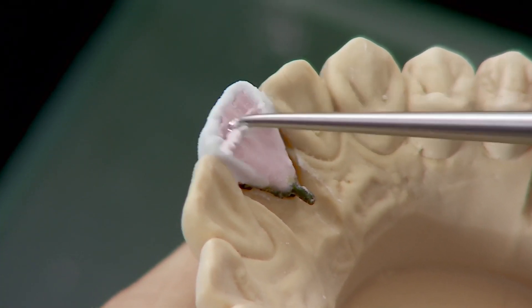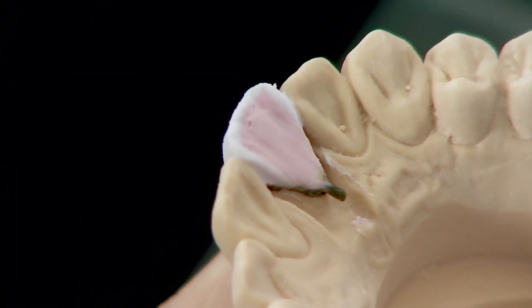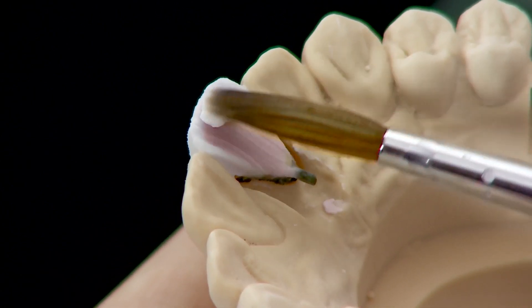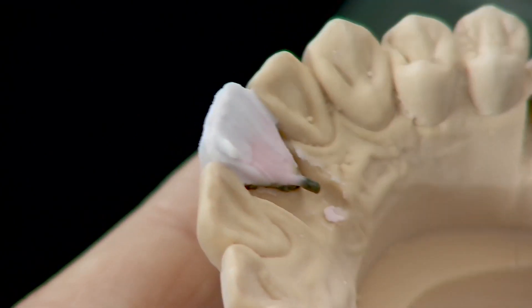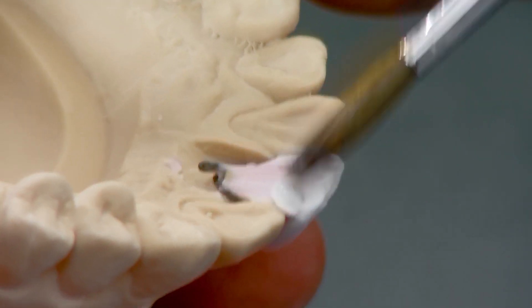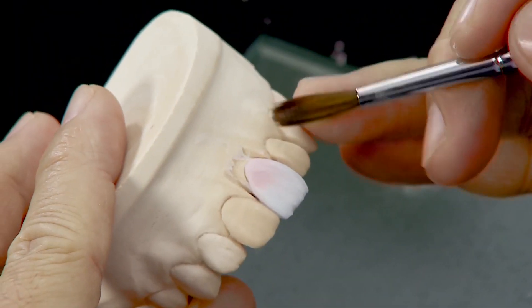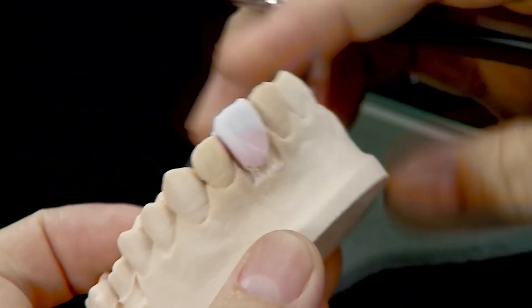Reduce the porcelain at the incisal edge both labially and lingually to obtain a sharp edge as seen in natural dentition. Cover the sharp incisal edges with Vintage MP Opal Aqua 58 enamel porcelain. Remove the excess porcelain from the proximal surface before removing the crown from the model.